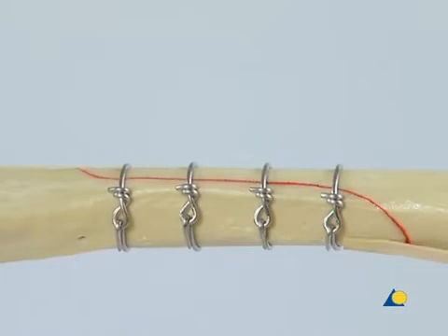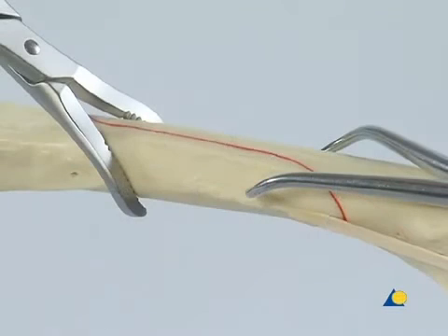Generally, cerclage wires should be equally spaced between one half and an entire bone diameter apart. The order in which the cerclage wires are applied is given by the position of the forceps.